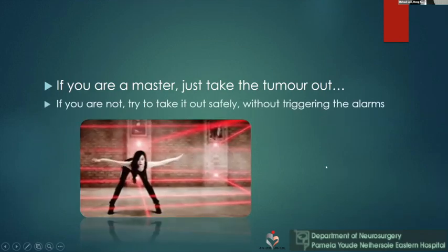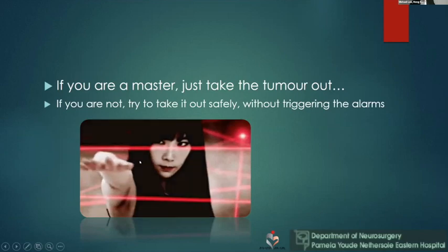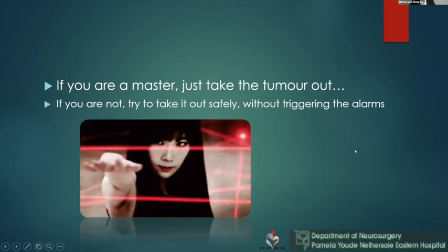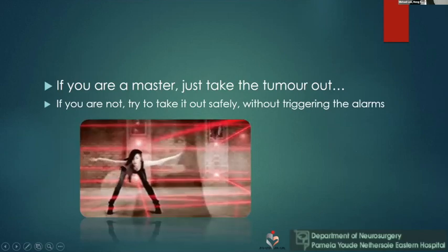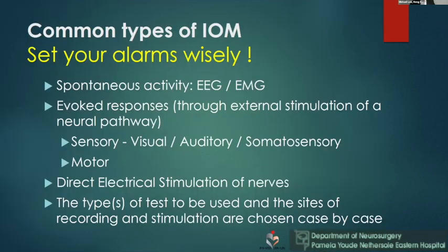So how can you take it out safely? Then probably you need a good alarm. Like the laser here, if you can see the laser, you can avoid problems, of course. So this is our basic IOM panel in my hospital. And these two are my nurses who help me to watch the IOM and warn me during the surgery.